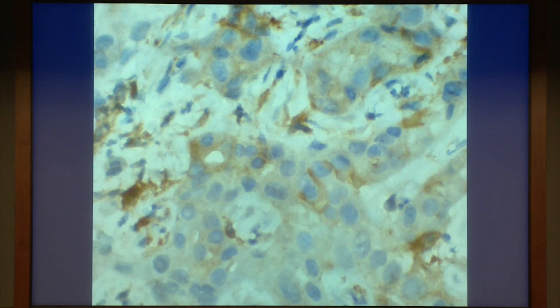The other sticky wicket here is that there's a propensity for inter-observer variability in the interpretation of the PD-L1 stain, not when it's completely negative and not when it's floridly positive, but when it's barely positive. We're meant to count membranous staining in tumor cells, and there's a little bit here. Ignore the cytoplasmic staining, but count the staining in lymphocytes and macrophages. And so you can imagine that can be challenging to come up with something.